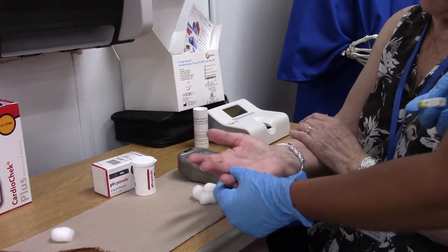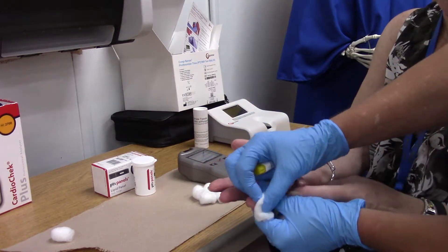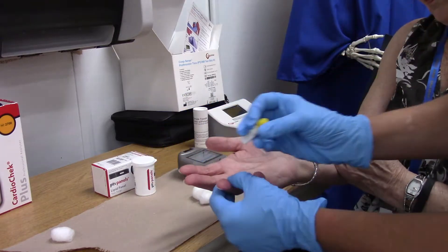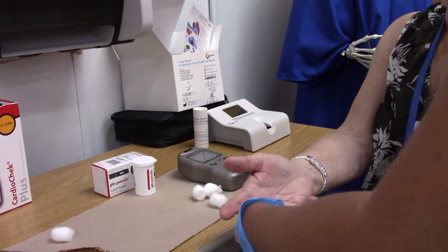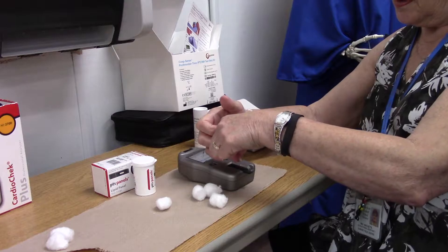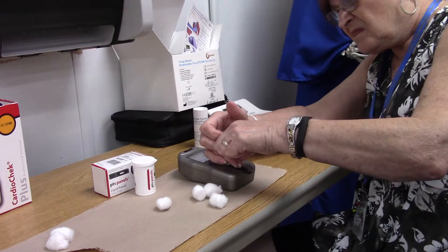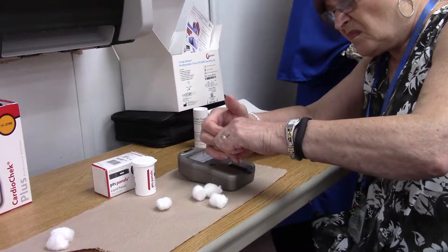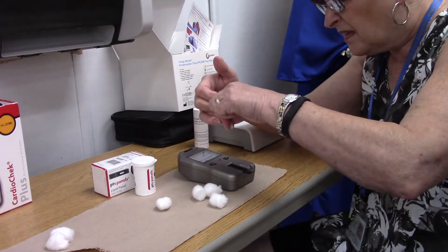At this point you puncture your patient. Clean the site and we're going to use the hanging drop method. You need a lot of blood for this.